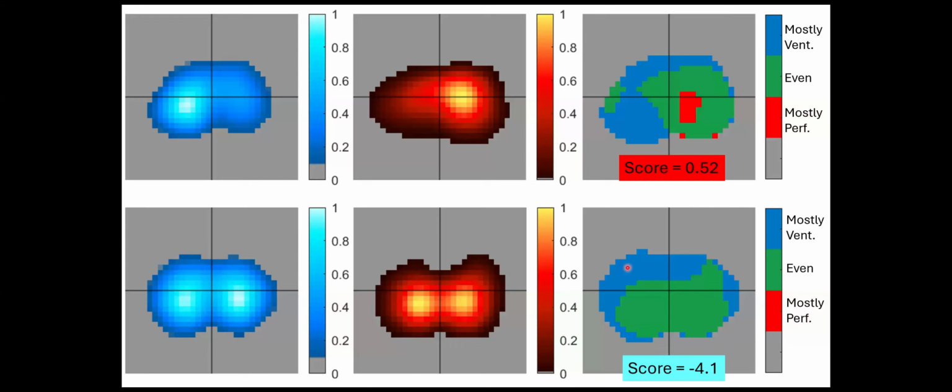It's interesting that this intelligent index of pulmonary emboli does not get confused by blue dots in the ventral part of the lung, because it understood and learned during the training that this could be just dead space caused by PEEP and not by pulmonary emboli.